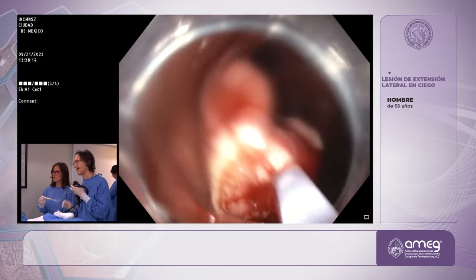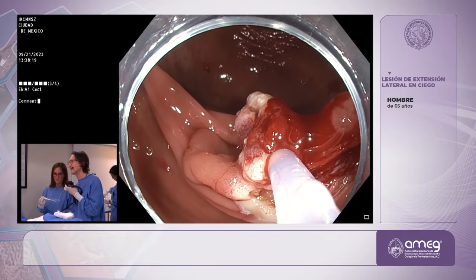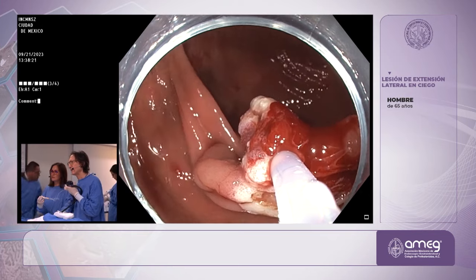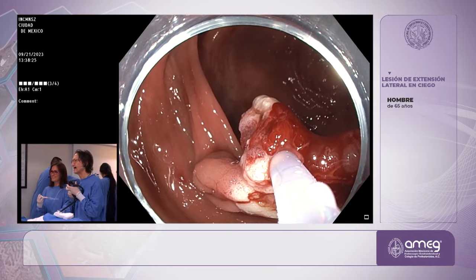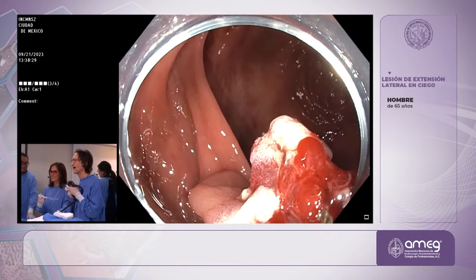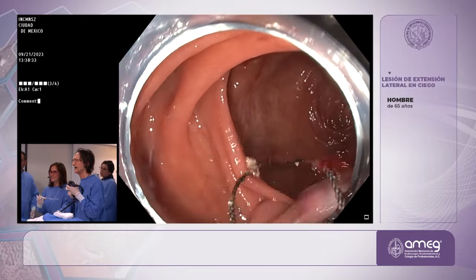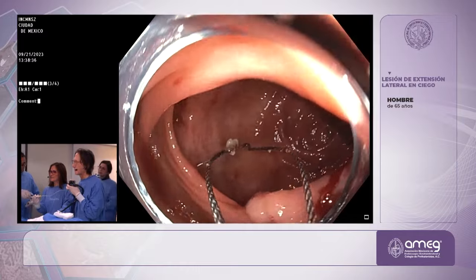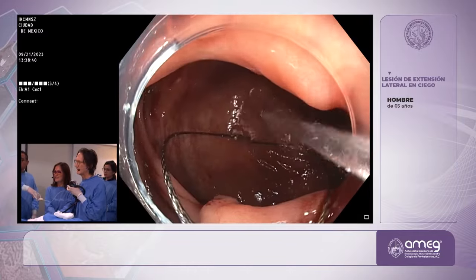Yeah, it looks like I might have to deal with hemostasis. I'm going to have you hold this like this, please. Yes. Okay. One moment. Let me get my glass. I am caught. Sorry. Open the snare again, please. Yes. So I'm not completely happy with this. It didn't really get it the way I wanted. I was hoping to. Open all the way, please. Put myself here. Open all the way. Okay, let's see.